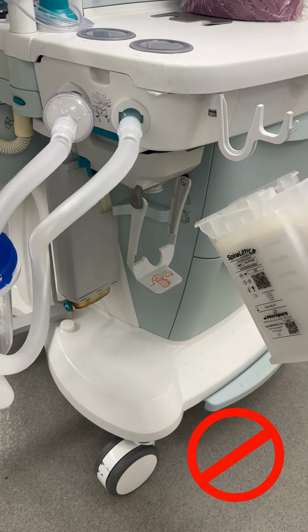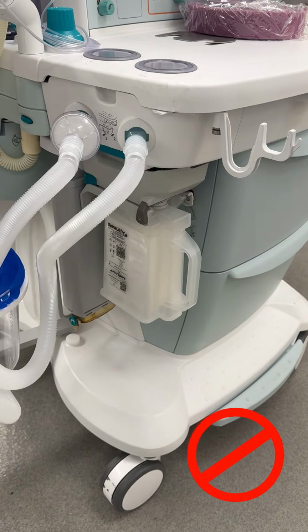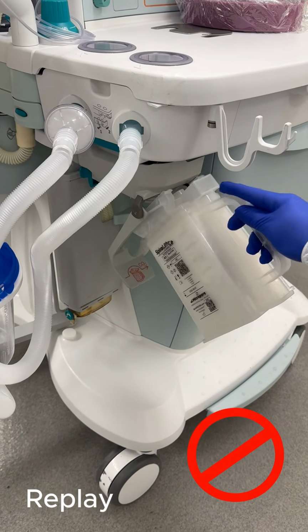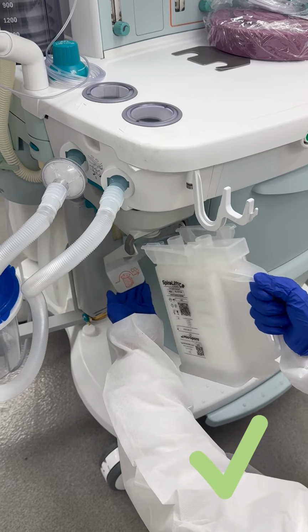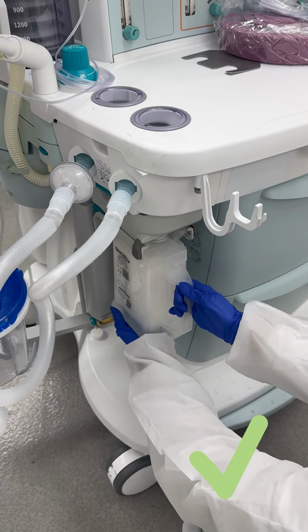Here is a technique that you should not use. It is called the one-hand slam. Do not use one hand to load the canister. This is a sure way to break or damage the canister and fail a pressure test. Instead, always use the second hand to support the canister from the bottom as demonstrated.